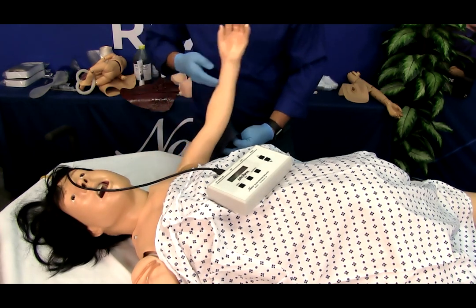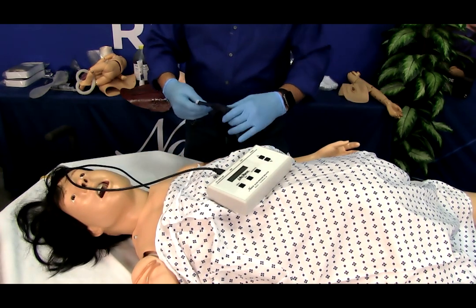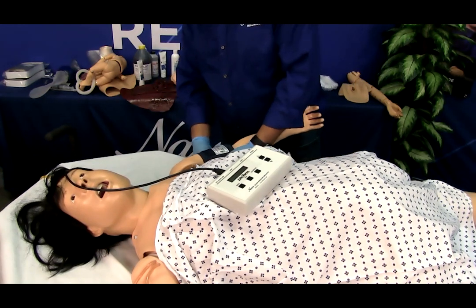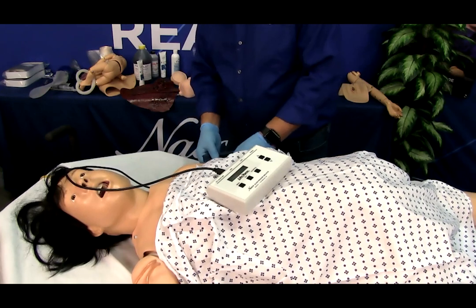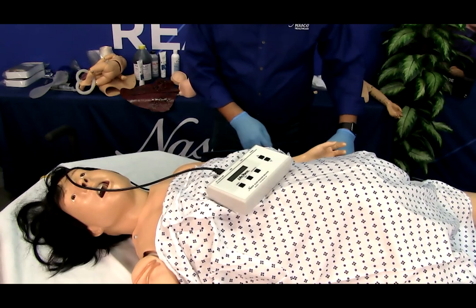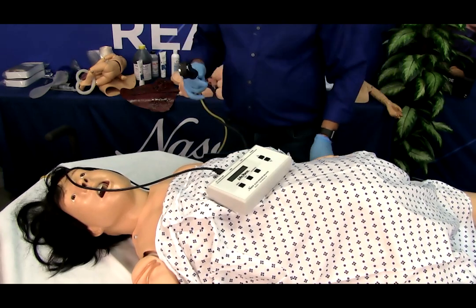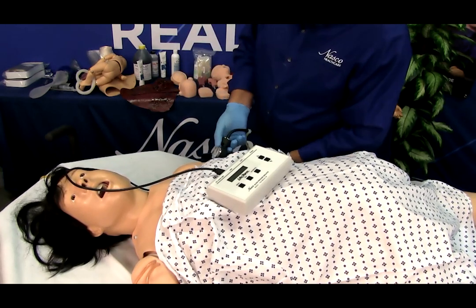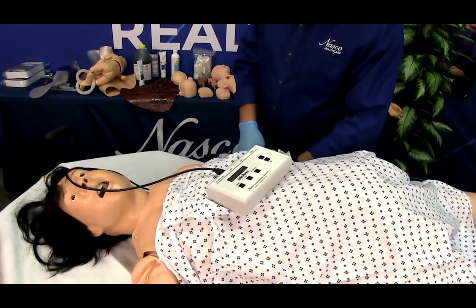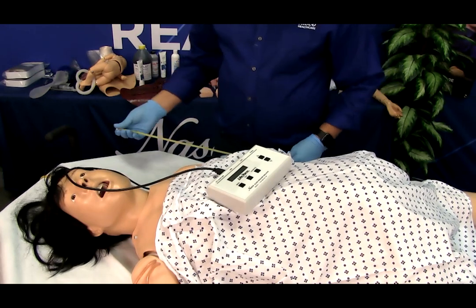At this point, the blood pressure simulator is ready for use. The unit has been factory calibrated for use with the accessories included. No further calibration adjustments are necessary at this time. If the unit is to be used with a blood pressure cuff other than the one supplied, or when recalibration is necessary, see the section titled Calibration Procedures in the instruction manual.